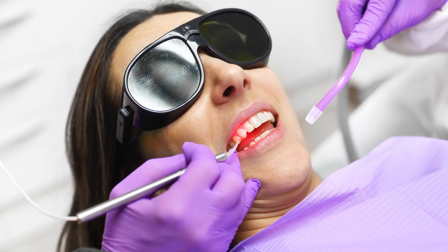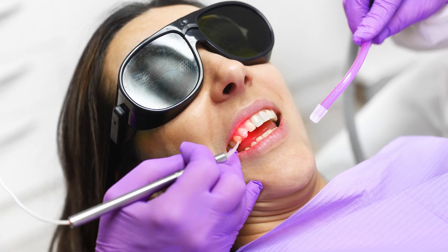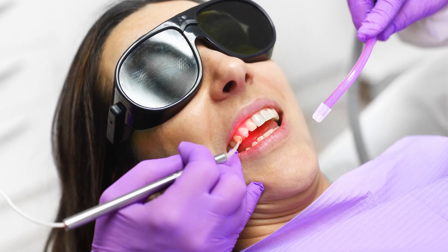We pre-measure everything. We can actually take pictures, and we have what's called a white line evaluation — it's a template that we overlay via the computer. Then we can make measurements and I can show you what it would look like. Patients find it makes a lot more sense; within less than five minutes it's understandable. We use the laser that cauterizes as we go — just picture looking at your front teeth and I'm following the contour of how the tooth should look.